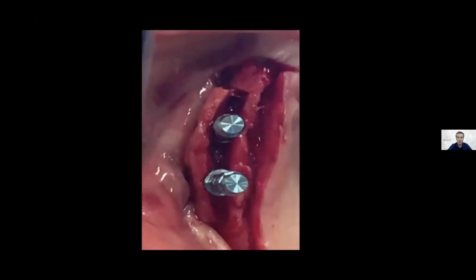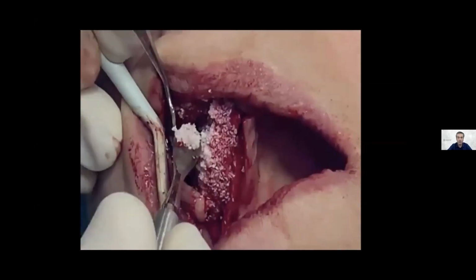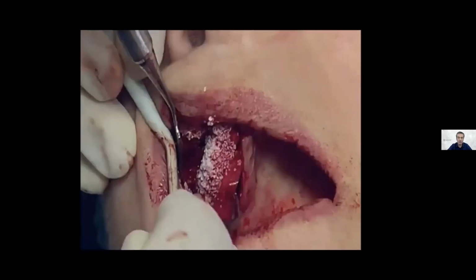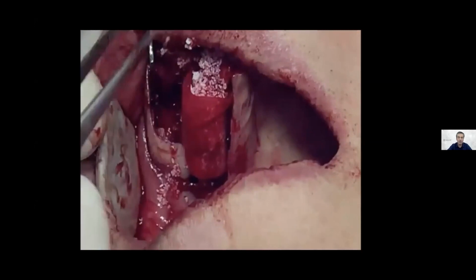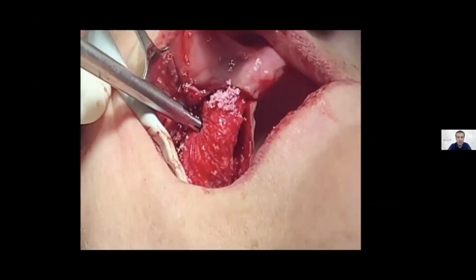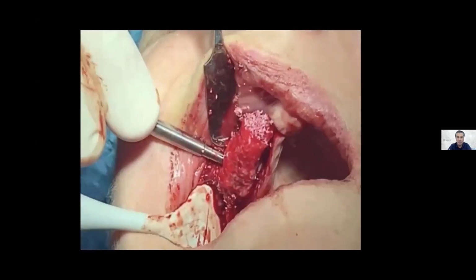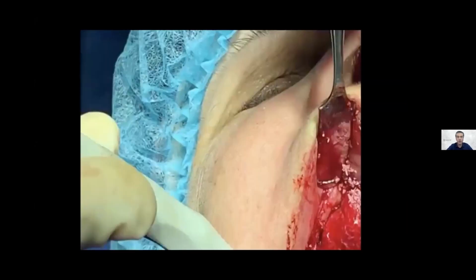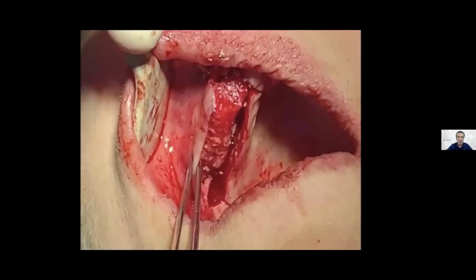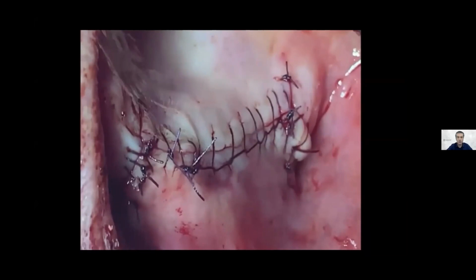And after that, we do our guided bone regeneration. Here, the resorbable membrane was fixed by 2 pins palatally. And now I am reconstructing the area buccally, and I will fix this resorbable membrane with pins. And by the way, I'm not making publicity, but Klockner pins for the mandible, they have special pins for the mandible. They are really amazing. Look how stable the membrane is, and the bone substitute underneath. And here, after releasing the periosteum, tension free, we can be safer with this technique.